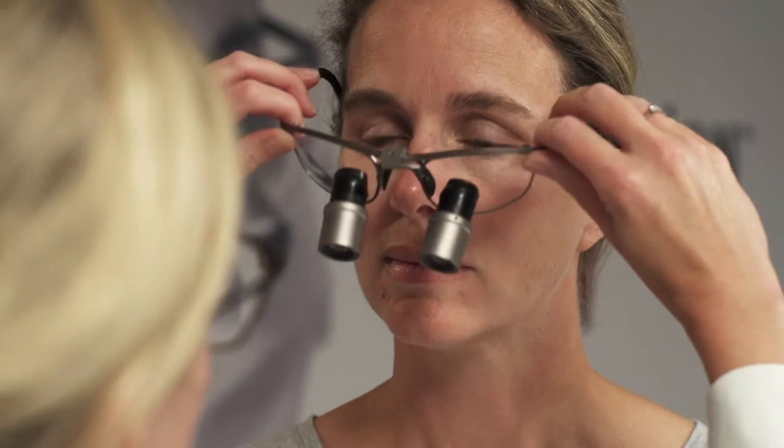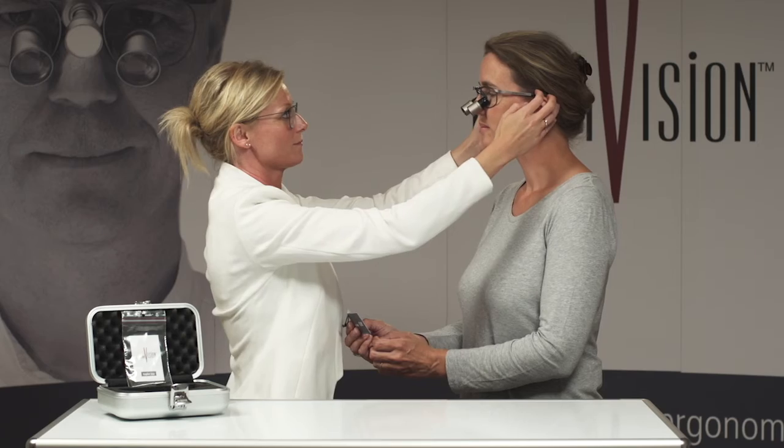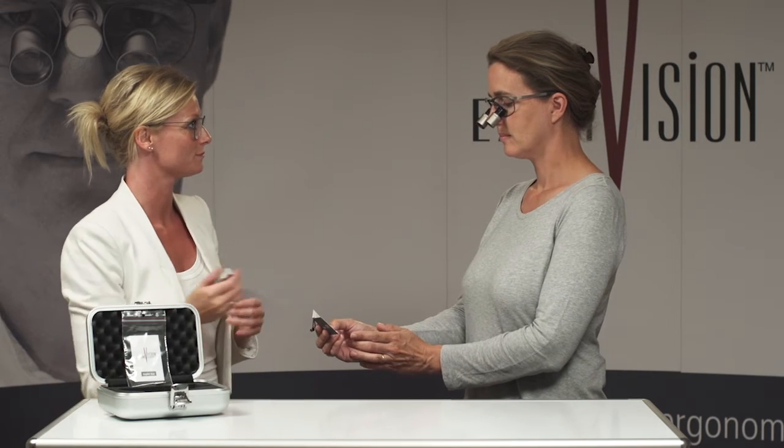Put on the loop and make sure it fits correctly. Find your working distance again.